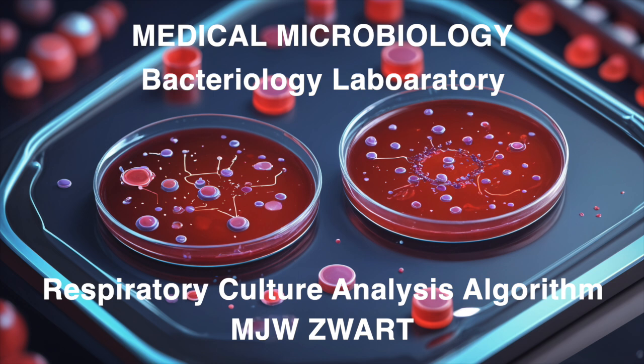A curveball, huh? Now you've got me intrigued. What kind of curveball are we talking about? Well, you know how S. pneumoniae is typically gram-positive? Those nice diplococci. Classic textbook picture. Right. But sometimes that thick capsule they have can actually make them look gram-negative on the stain. Oh, wow, really? So it's like a disguise. Kind of. It's a good reminder that we can't always rely on the gram stain alone. Definitely. Got to keep our eyes peeled for those sneaky bacteria.